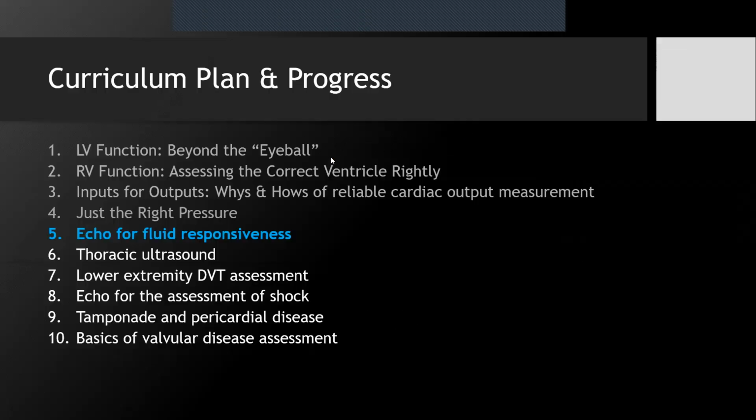This is where we are holding in our curriculum plan in progress. So this is our 5th lecture. The first 4 were really LV 101 and 102, RV 101 and 102. This is the first lecture where we're going to be getting into some bit of integration, which is the whole point. So I'm very excited about that.